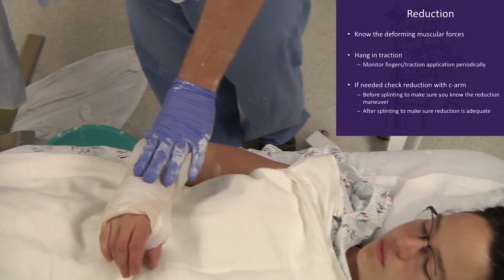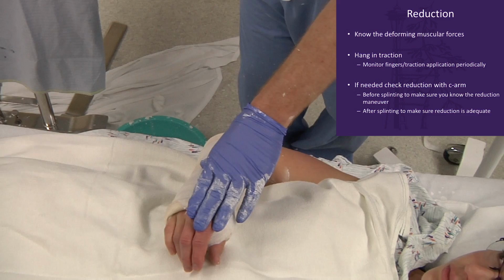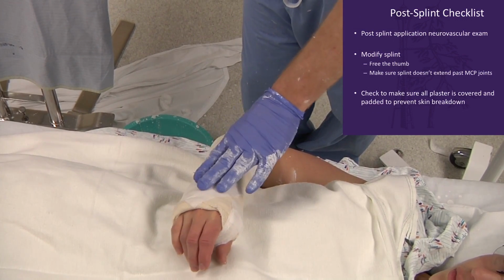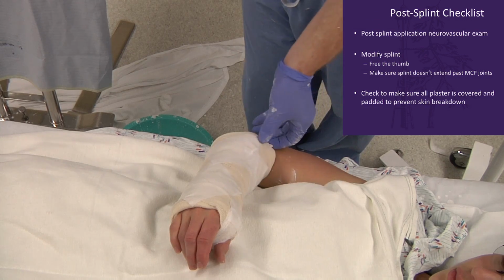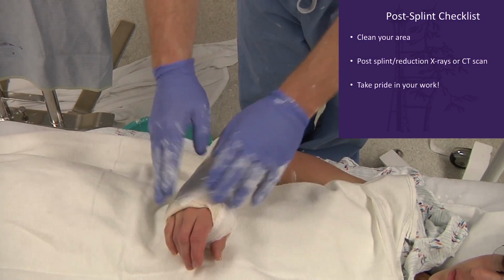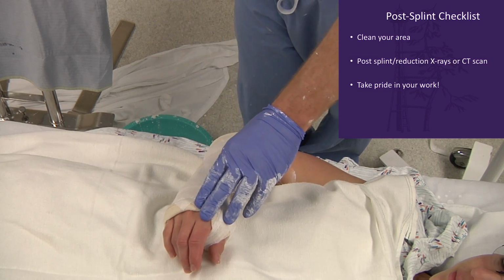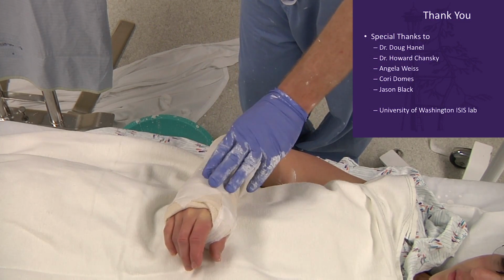Always make sure once you are done with your splint that you perform a thorough neurovascular exam. If there's any negative changes, think about removing your splint or what might be causing that. Always check the tops and the bottoms, making sure that your plaster is well padded and not irritating the skin where it can cause ulcers or pressure issues.